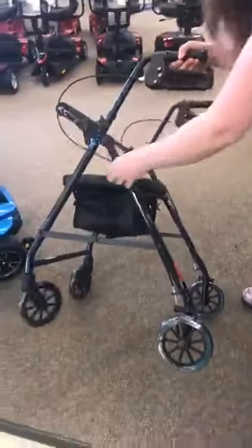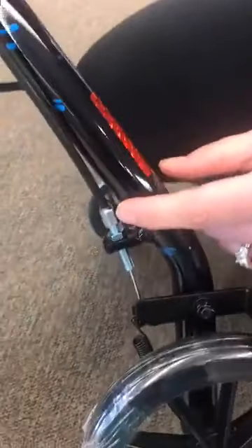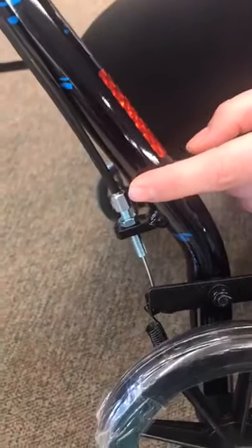So on your brake cables, if you come all the way down to the bottom of your back tires, most of the rollators' brakes are on the back wheels. So this is something to remember, but you just follow your brake cable down to the tire that it's actually on. You have a little nut right here. Loosening and tightening that nut is going to adjust your brakes.